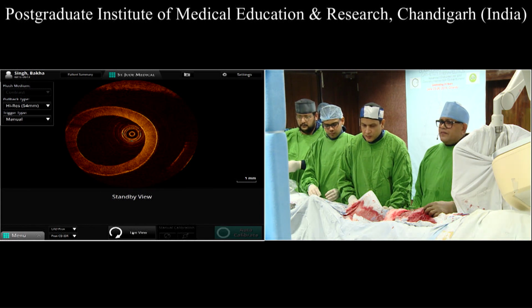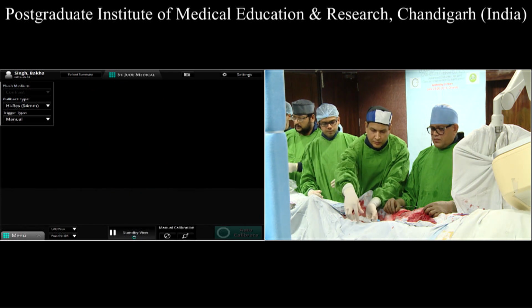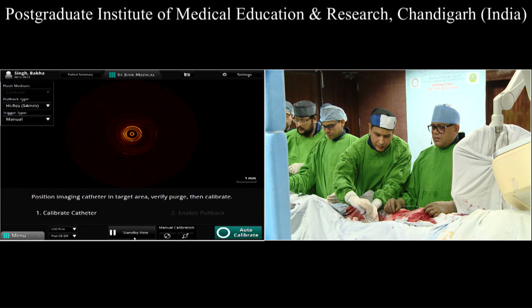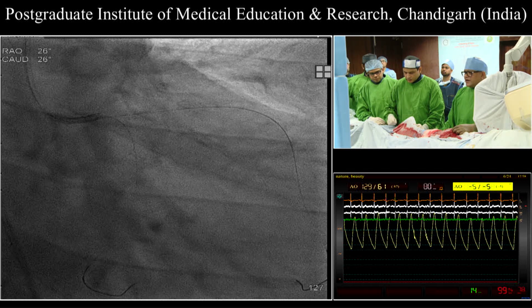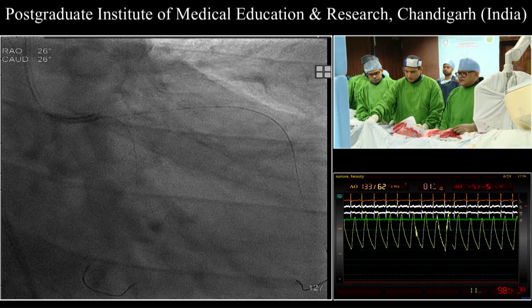Comments here were that the cutting balloon 2.5 was probably undersized and we suggested here to use bigger cutting balloons. What have you decided and what is your analysis post-OCT? See, a cutting balloon of a size which is say 3 millimeter in a stent which is 2.75, I'm somewhat skeptical about getting the cutting balloon stuck up there with the stent struts.